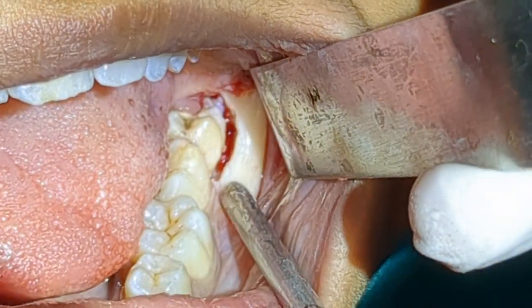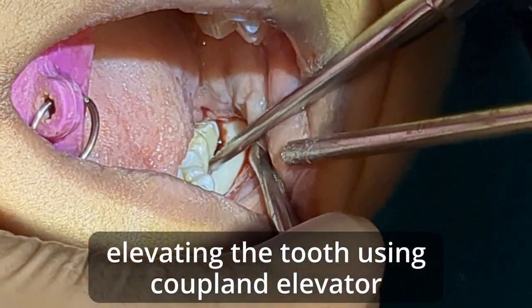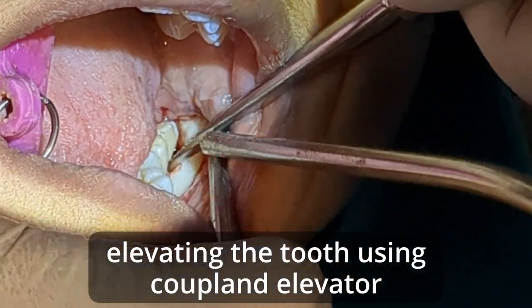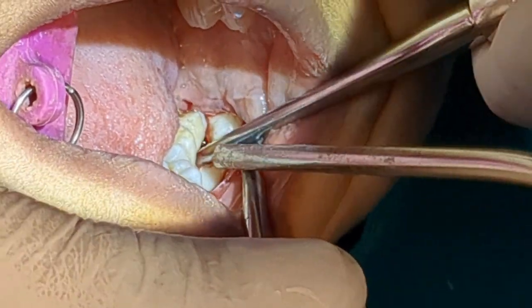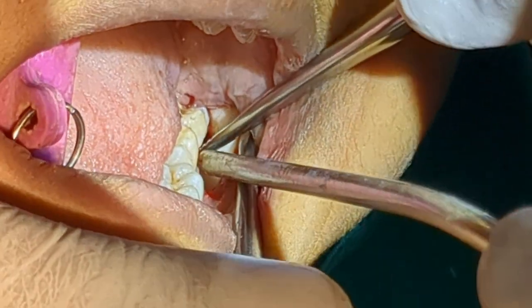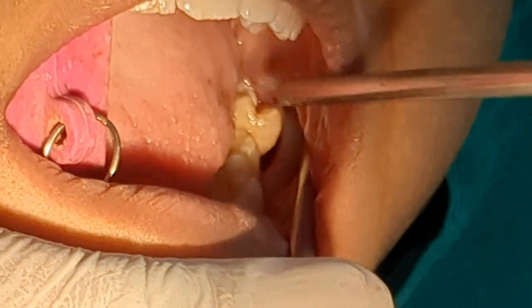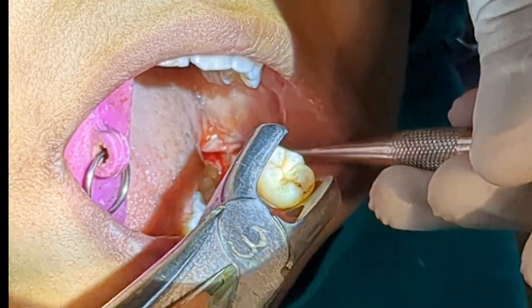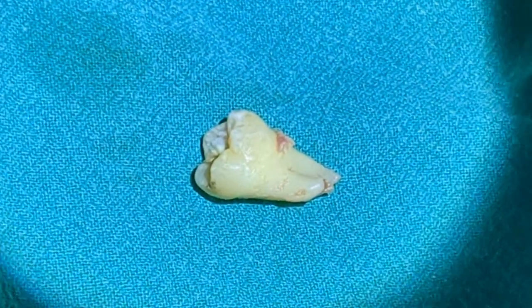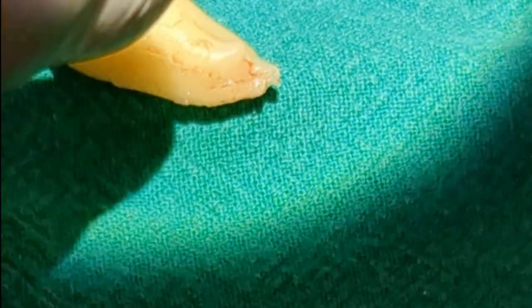You can see I can now use the Coupland elevator. Just rotating it, it should come out — you can see it is luxated now. I'm just elevating it. This is the extracted tooth here.